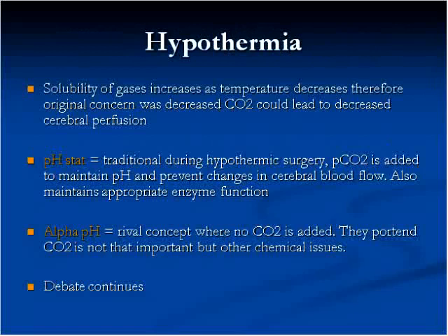So during pH stat, that terminology is an OR term primarily at this point, and PCO2 is added. It's kind of like the old standardized bicarb where CO2 is added. And I'm not sure exactly how that's done, but that is the common practice.